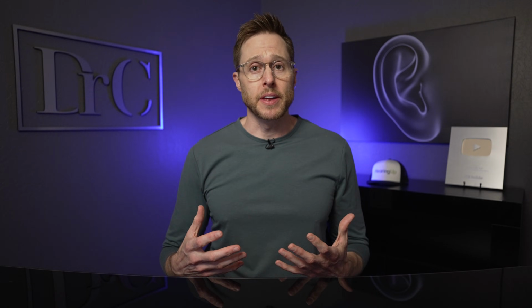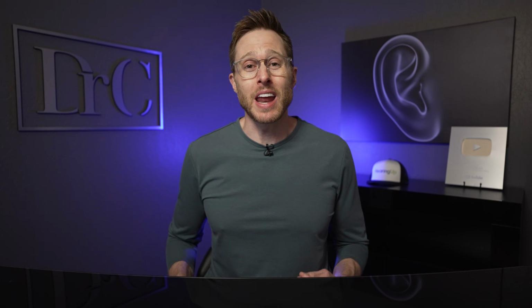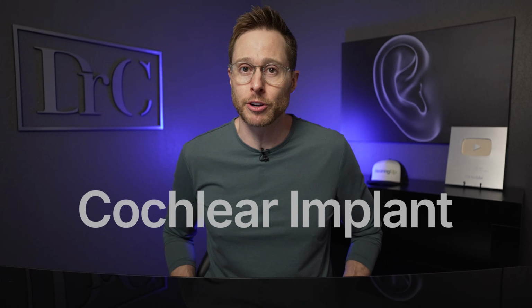So I have a hearing aid patient that I've been working with for the past 5 years or so that I've been virtually begging to get a cochlear implant because his hearing is so bad. I mean, his hearing is so bad that he can't even wear a hearing aid in one of his ears, and in his opposite ear, his word recognition ability is so low that it provides him with almost no benefit at all. And one thing is for sure, he would absolutely be able to hear better than what he does now if he'd be willing to get a cochlear implant.